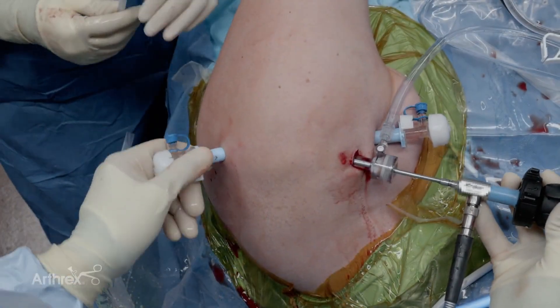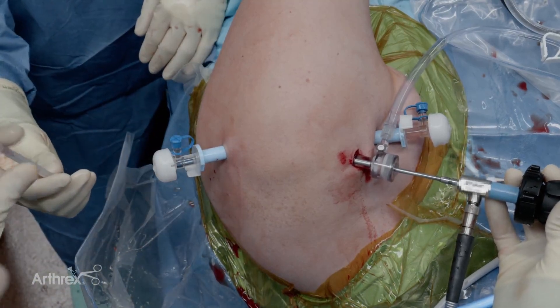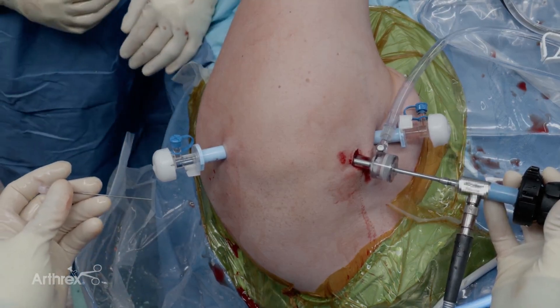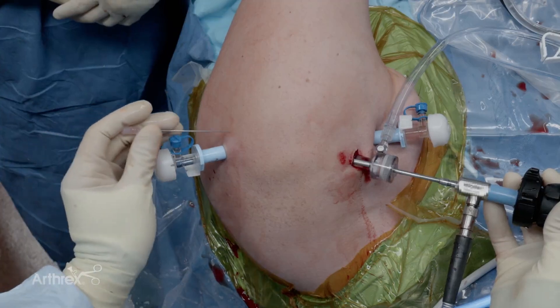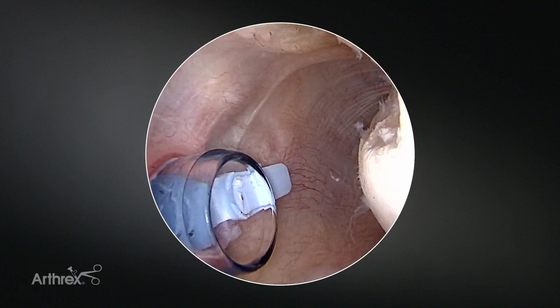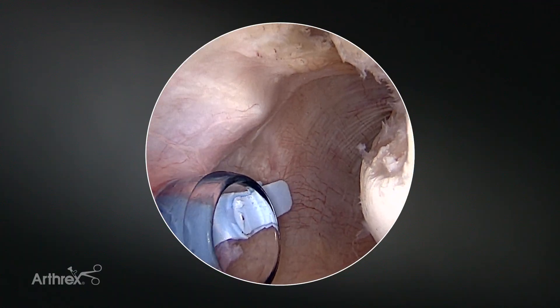Our defect is completely prepped. My next step is to place an accessory posterior cannula. I like to use a spinal needle first. This cannula is typically directly lateral to my posterior inferior cannula. Usually it's going to be two to three centimeters and I want to get an angle approach that's going to aim toward the middle of the Hill-Sachs defect.